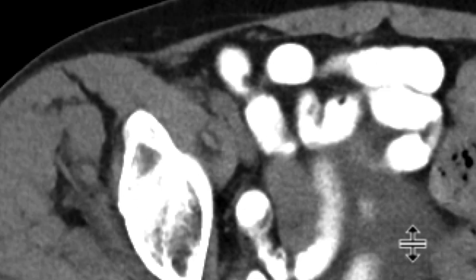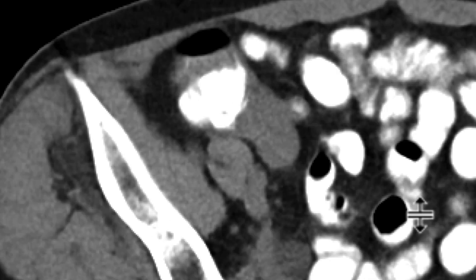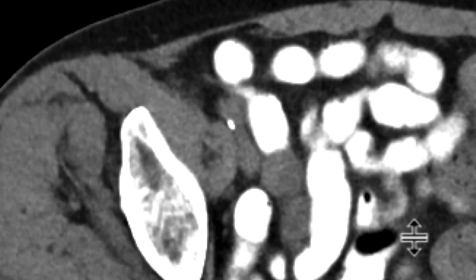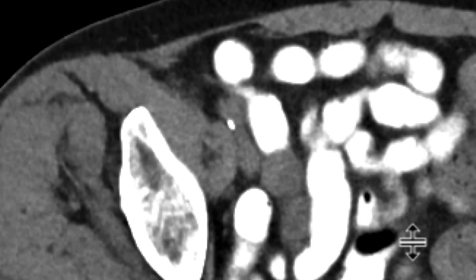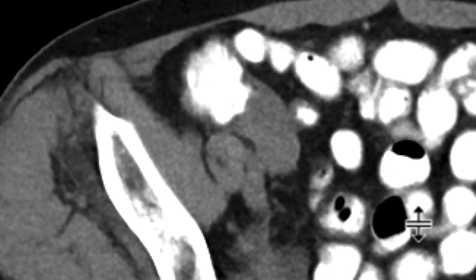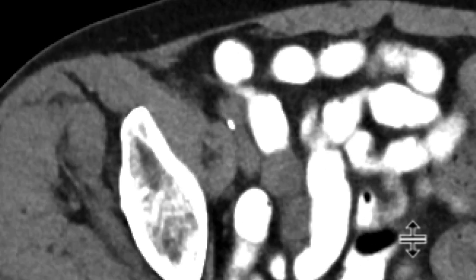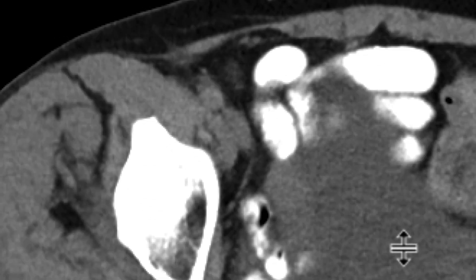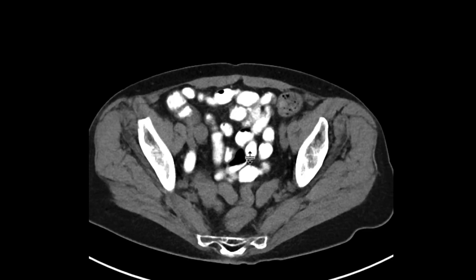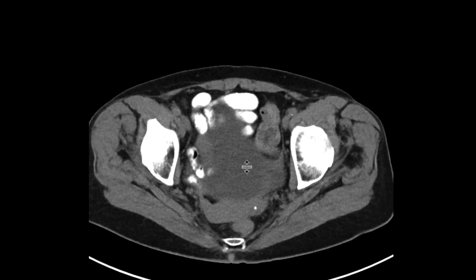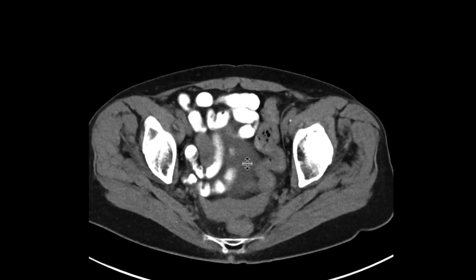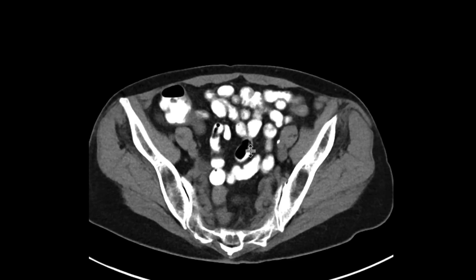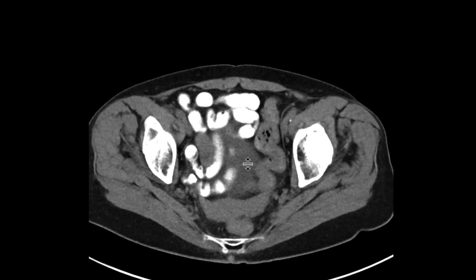That's going to be the appendix, and it's filled with this soft tissue. There's no inflammatory change around it to suggest acute appendicitis, but rather, when you see this sort of soft tissue, we worry that there's an underlying neoplasm resulting in a mucocele. This ended up being resected, and it was a moderately differentiated adenocarcinoma of the appendix.